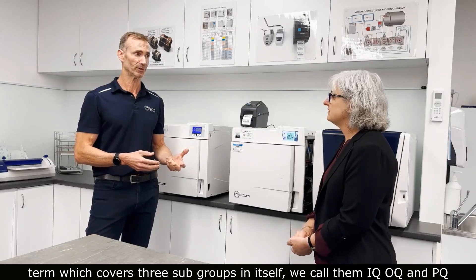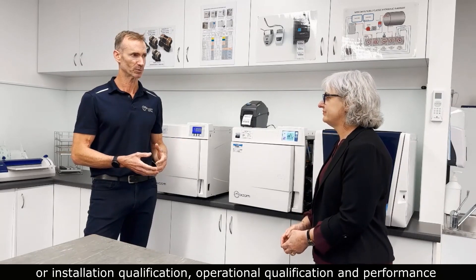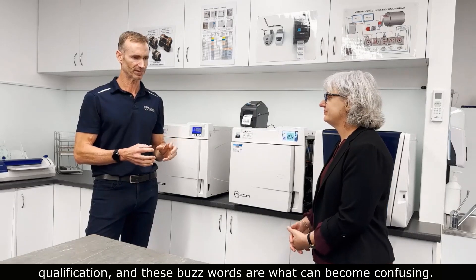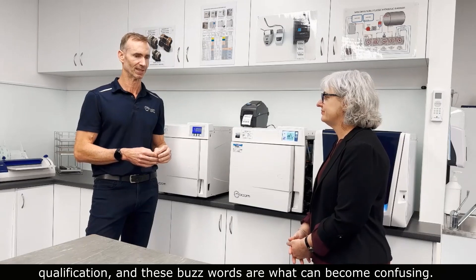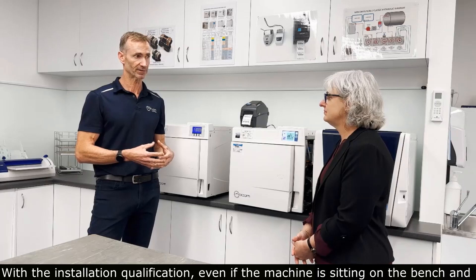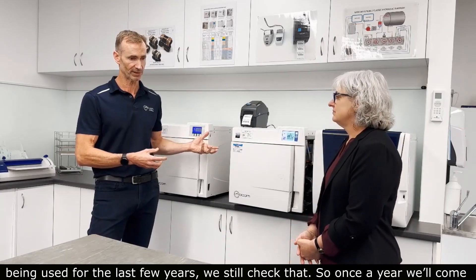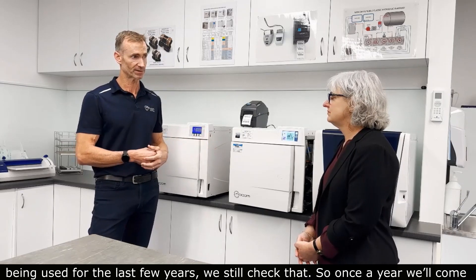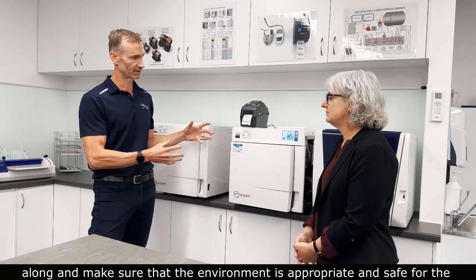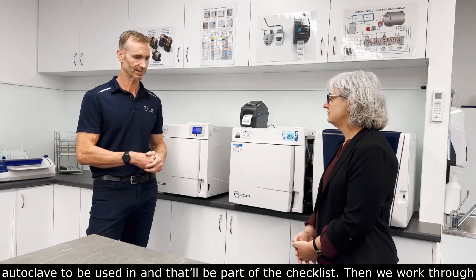We call them IQ, OQ, and PQ — or Installation Qualification, Operational Qualification, and Performance Qualification — and these buzzwords are what can become confusing. With the Installation Qualification, even if the machine has been sitting on the bench and being used for the last few years, we still check that. Once a year we'll come along and make sure that the environment is appropriate and safe for the autoclave to be used in, and that'll be part of the checklist.